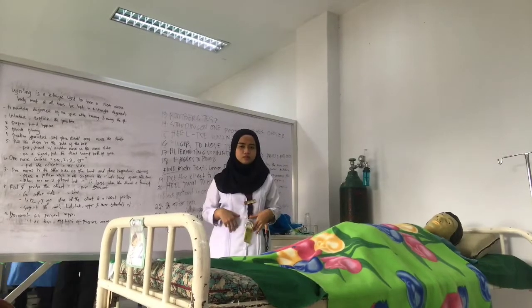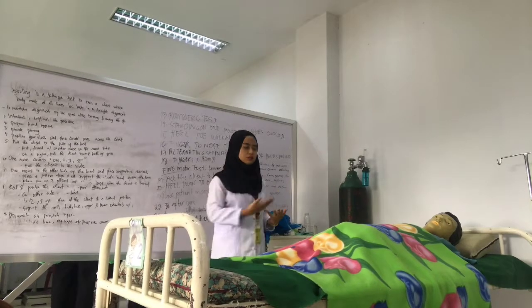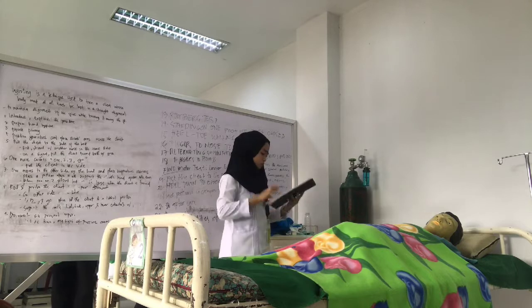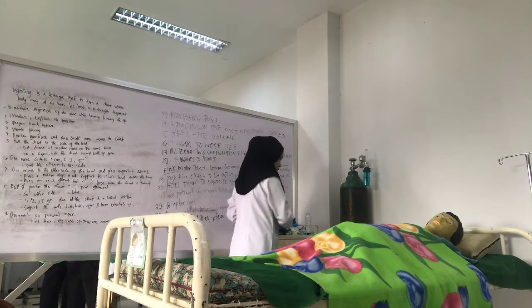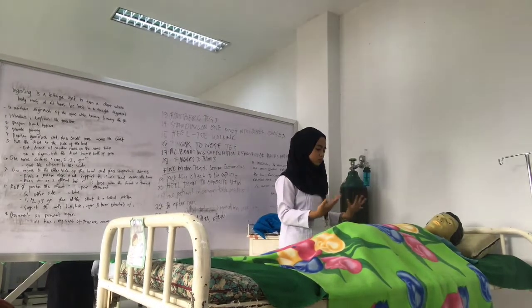Administering oxygen by cannula and face mask. Verify written order for oxygen therapy, including methods of delivery and flow rate. This is to avoid medical error. Introduce self and verify the client's identity. This is to make sure procedure is done to the right client.